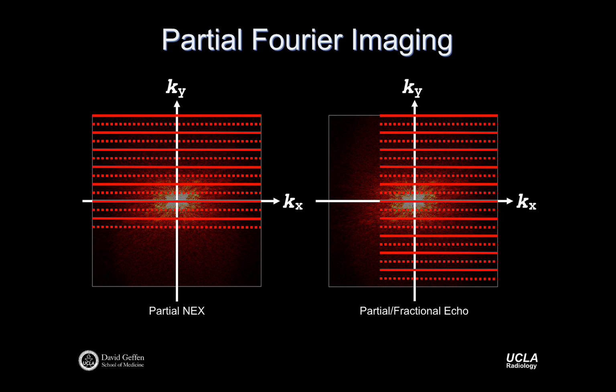We won't get into the reconstruction methods in this class. They'll pick that up in 229. But there are good ways to estimate this data if you have, say, more than half of k-space. The reason is you can generate a low-resolution image from the middle of k-space. You have all of the data in the middle, so to speak. That's low resolution, but these background effects we were talking about tend to be low-resolution things. They're not really changing at high spatial frequencies. So we can use the top data here to help inform or estimate the bottom data here.